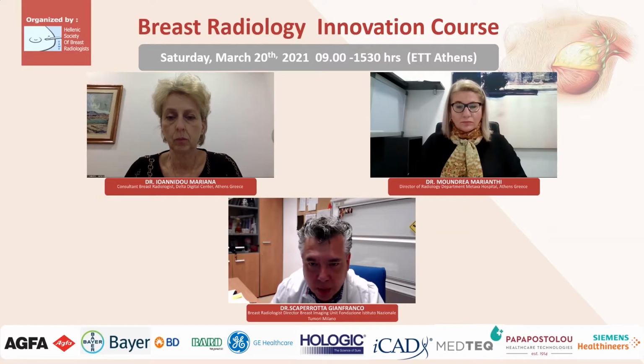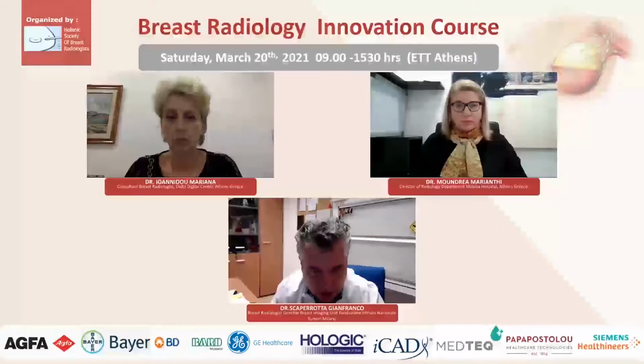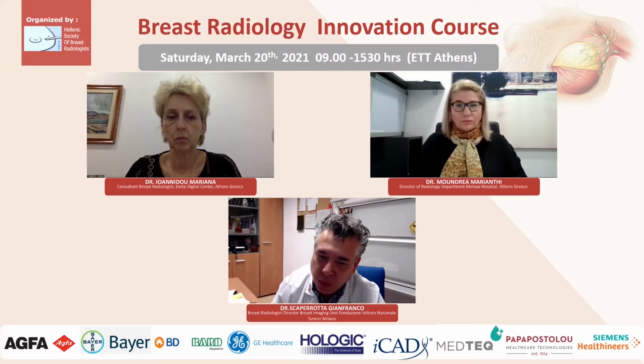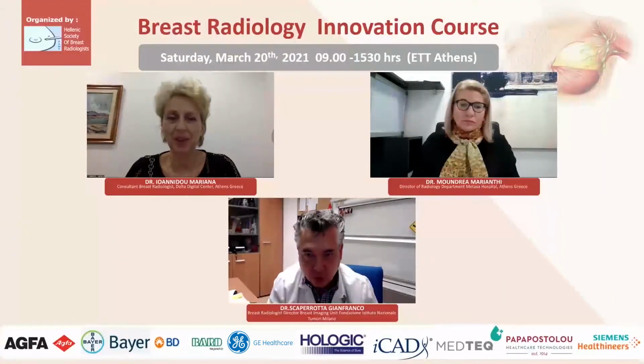We don't stop the normal approach, the normal strategy that I use in normal clinical activity. We use CEDM to understand whether there is a high-grade situation, I think high-grade DCIS, but we don't change the approach after the BI-RADS classification and stratification. And today, this is the situation.